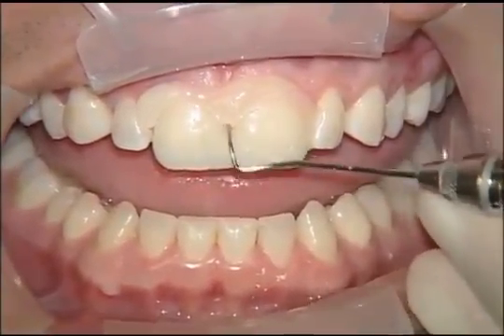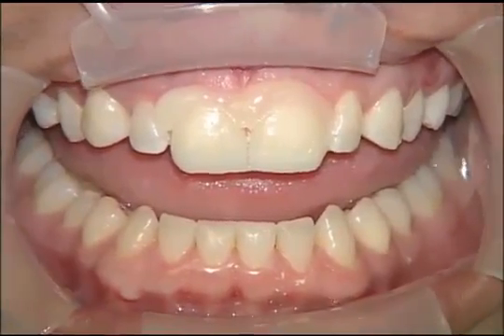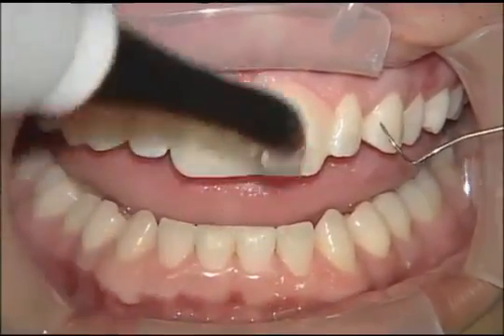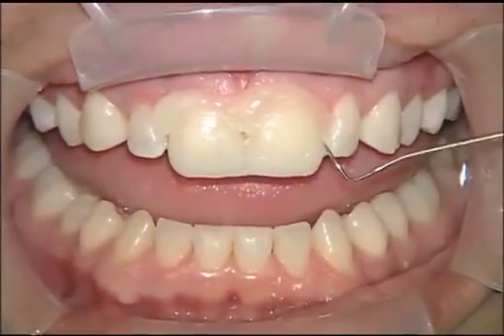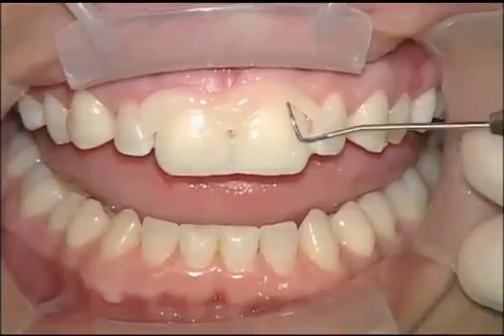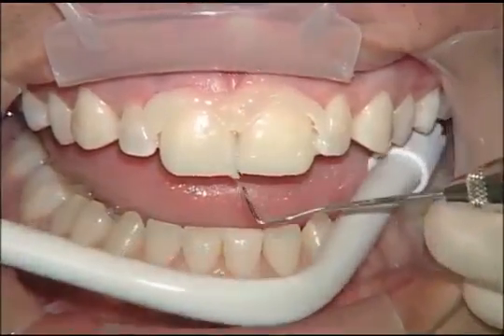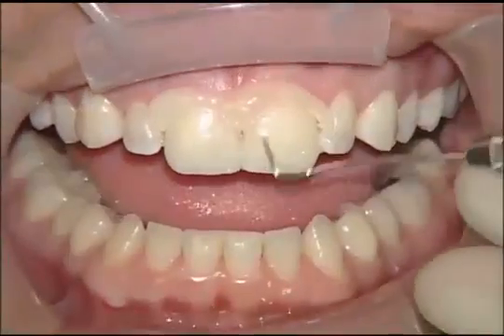The thinner veneer cements tend to run everywhere, and it's a little more difficult to do it. And I can see over here on the distal that it's not quite cured yet, so she's going to give me another 1.5 seconds, 2 seconds, and we're going to see, and that appears to have set it up. So we'll go ahead and be able to remove this in one big piece. This is nice because this is the way we're used to cleaning up crown and bridge cases when we use conventional crown and bridge cement.